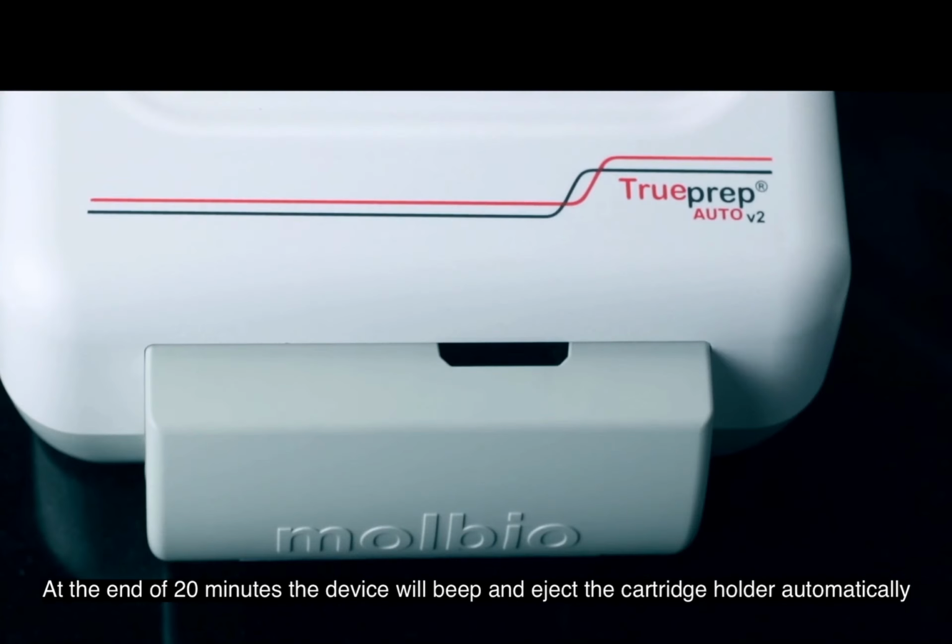So this usually takes DNA extraction 20 minutes. Okay, 20 minutes. And it slowly ejects. There will be a beep and it will eject. So here you have to be very careful. Once you load the cartridge, after that you cannot wait. If you load the cartridge, you have to do the test. Then other thing is, once you finish this extraction, you should not leave the cartridge inside because this machine is under tremendous heat. There's a lot of heat inside. If you leave the cartridge inside for a prolonged time, whatever DNA is extracted, the elute is there. Only from 3 ml of your sample, around 100 microliter of elute will be there. So if you leave it inside the machine, what will happen? That elute will get evaporated, then your entire test will fail.